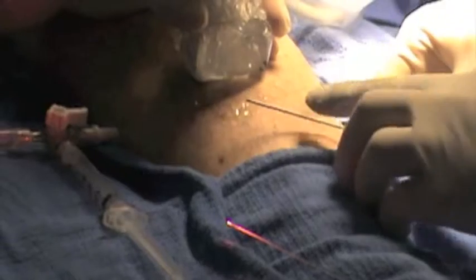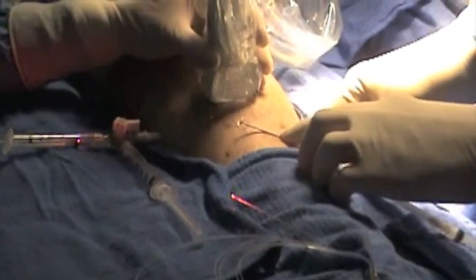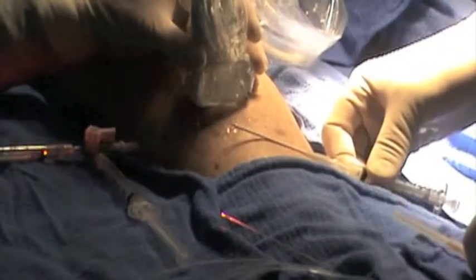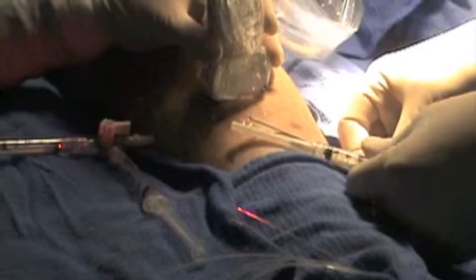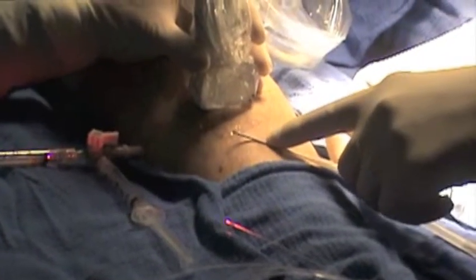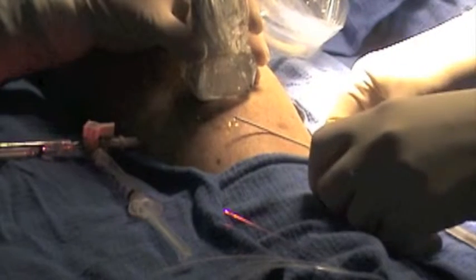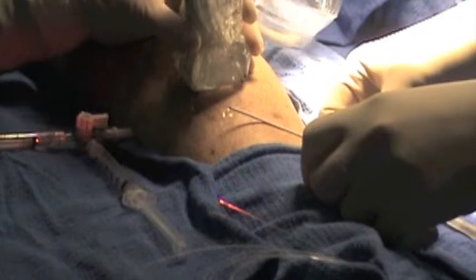We're going to use a 16-gauge angio-cath to access the perforator — you can also do this through a needle. I'll place the laser filament through here. After the laser filament is in, I'll inject about 2 cc's of 1% polidocanol foam. I'll then put the laser filament through the perforator, then we'll put tumescent, and fire the laser after the foam's in.